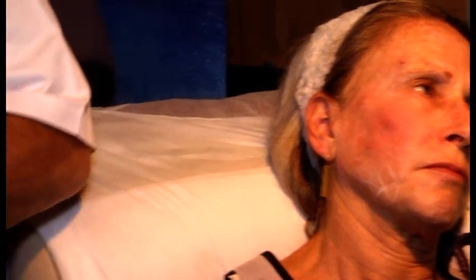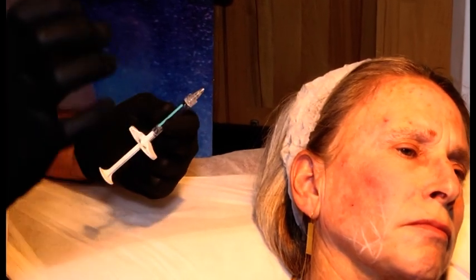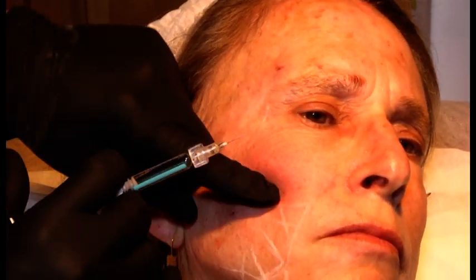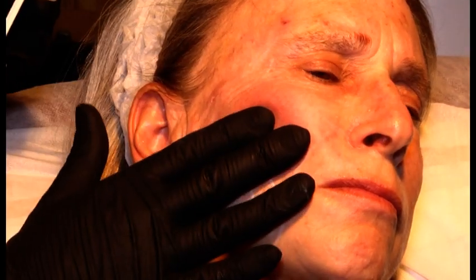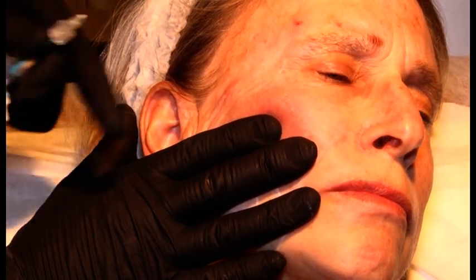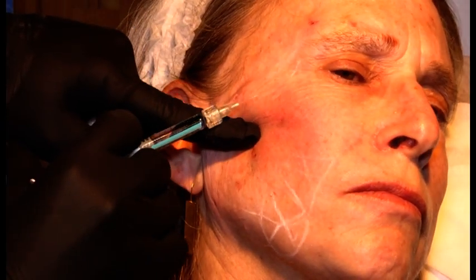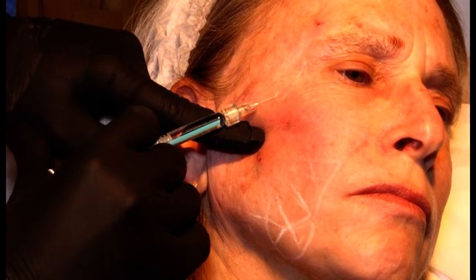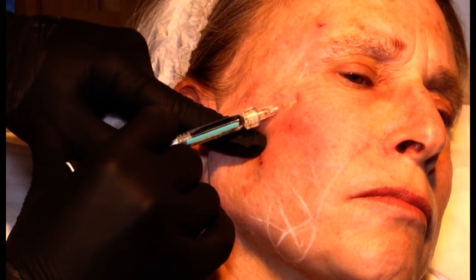All right. So this is the newest Belotero product, and it does not contain any lidocaine. So sometimes it's nice to cool the patient, also for a little bit of vasoconstriction, and maybe sometimes to give a little bit of anesthetic cream. Now, I want to inject in this area especially, because there's a lot of wrinkles, but it doesn't look good if you put any toxin there. If you put toxin there, the smile becomes very strange. So I will just inject some superficial, just subcutaneous deposits of Belotero Revive.